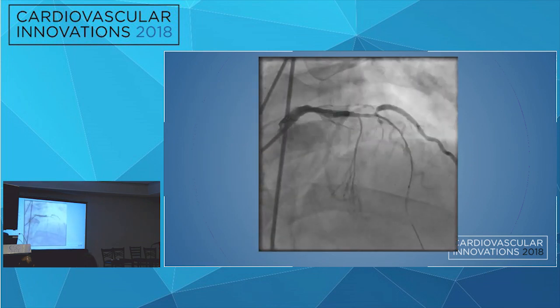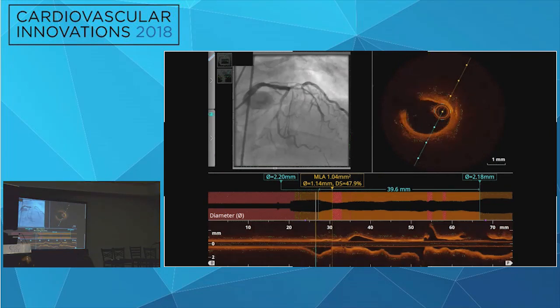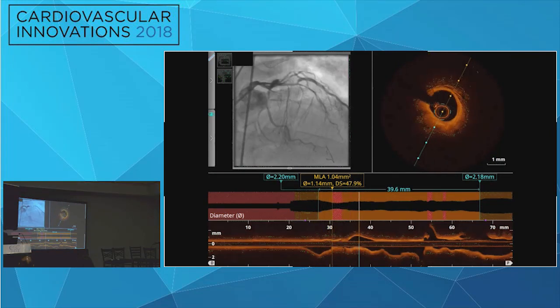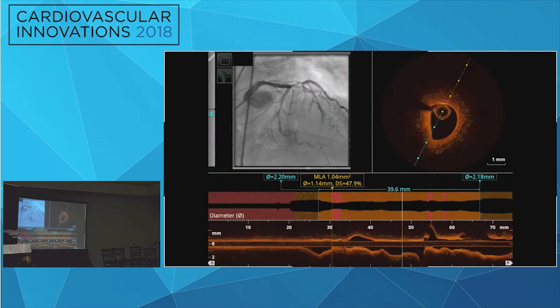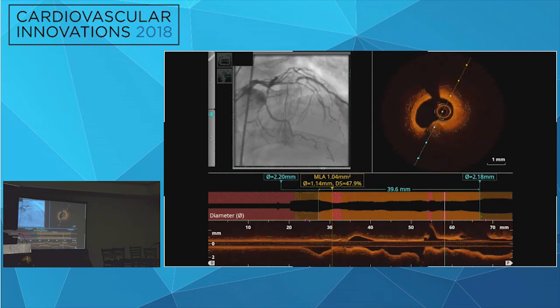So in this case, as we often do, we used OCT almost exclusively in these patients, and this is our OCT run of the vessel. There is a tightly narrowed segment in the mid-LAD just prior to that diagonal, as I will show in the subsequent slide.